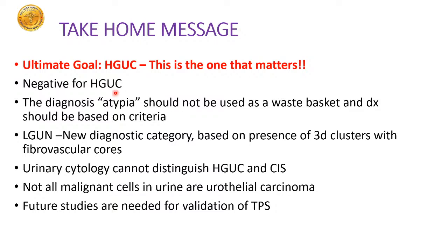The criteria, as I've already told you, for negative for high-grade urothelial cancer include all those categories which you can name. You may have atypia due to stones, atypia due to viral inclusions, due to treatment effects. Please call them negative for high-grade urothelial carcinoma and you can classify it further. The diagnosis atypia, please do not use it to sit on the fence or as a wastebasket diagnostic terminology. There are well-defined criteria. We've already covered this, one required and one minor criterion. Try to fit it into that. If it doesn't happen, then we sometimes do get those problems.